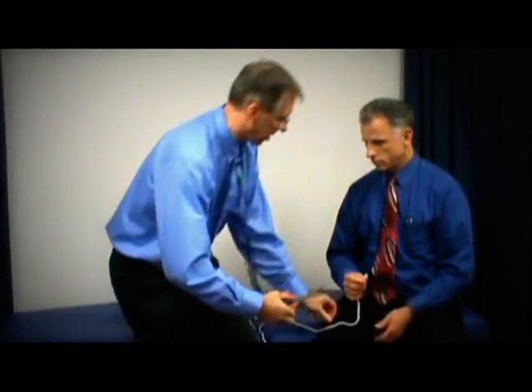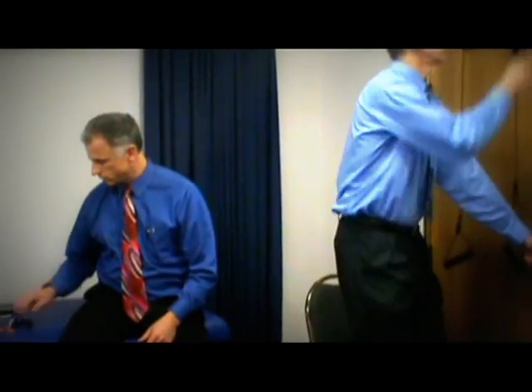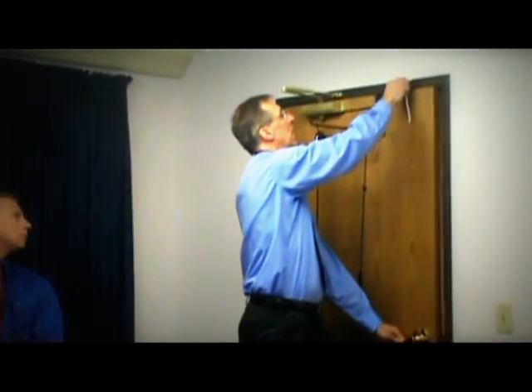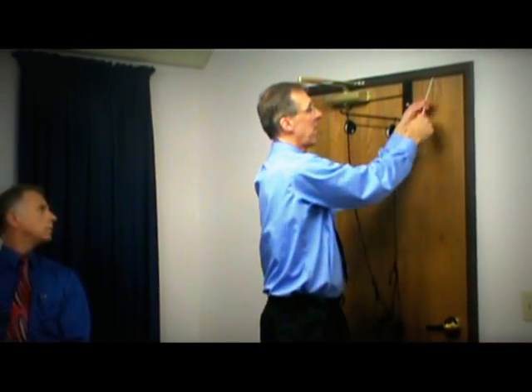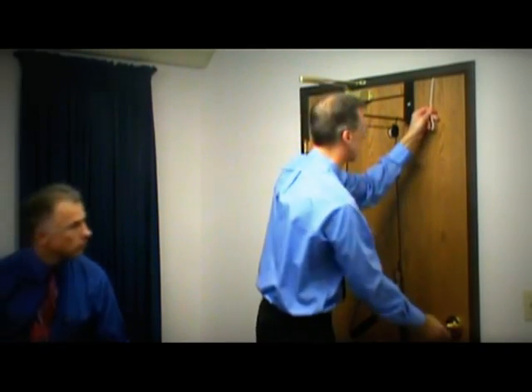So you can actually cut it, and you got a knot in there already. Yeah, I want you to show this. So you cut this, you attach it to the pulley, and now you have this knot here. And what you do is, come on over here, you just close the door on it like this, and this part's attached to your pulley system, so that's going to stay in place now. Does that all make sense? That clear as mud, as one of my instructors used to say.